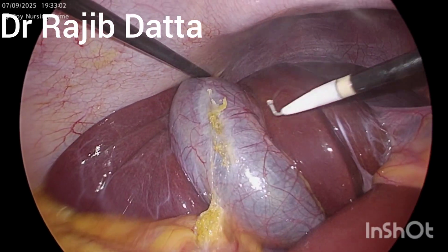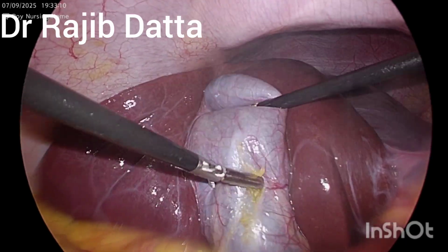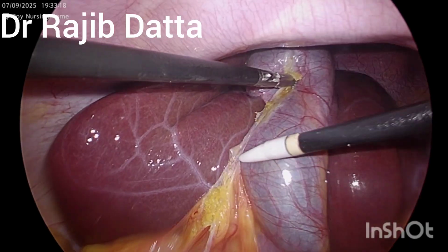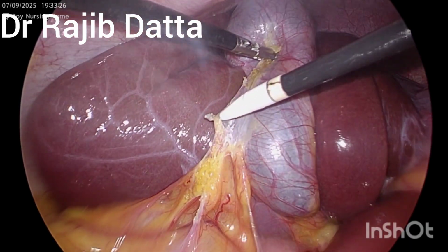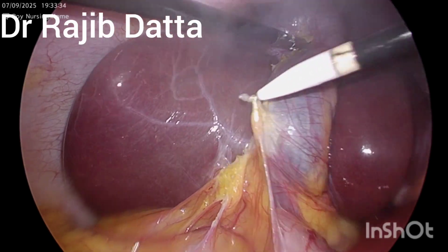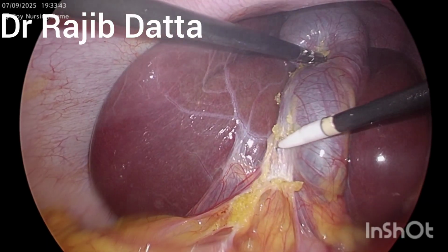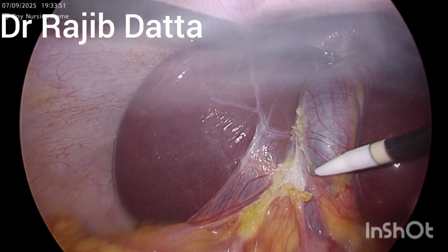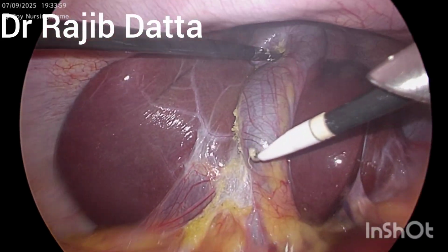Traction and counter traction is going on. So again we are retracting the gallbladder towards the ipsilateral shoulder, that is towards the right shoulder. So again the monopolar diathermy hook is an excellent instrument for controlling the adhesiolysis as well as the hemostasis at the same time. You can well appreciate that the stomach and part of the duodenum are also adhered to these adhesions.